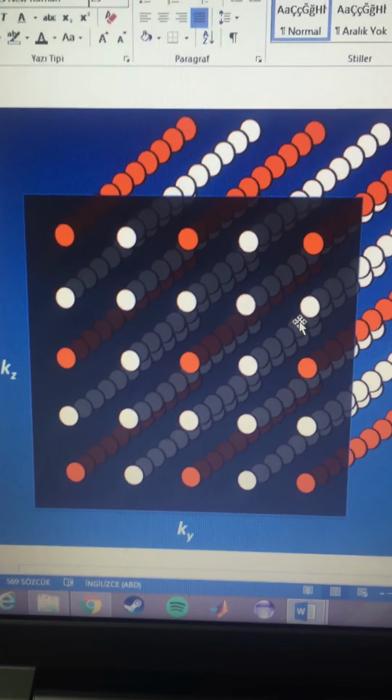Now, I'm going to show my second example, which is acceleration in 2 directions. Here is the image. In this figure, the acceleration is split between 2 different directions, which are the Ky and Kz directions. Every other line of data has been skipped in each of the 2 phase encode directions. The total acceleration remains at 4, which is R equals 2 times 2 equals 4.